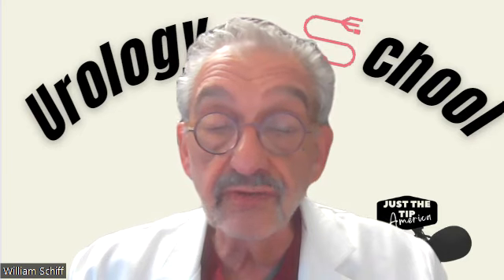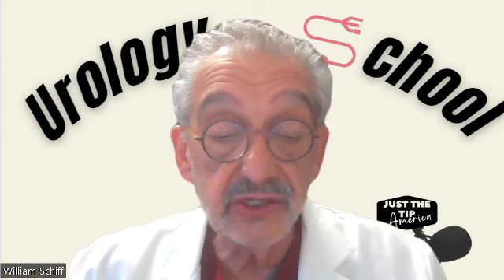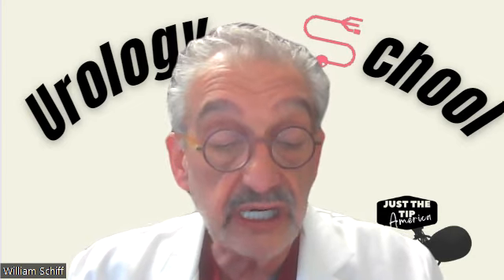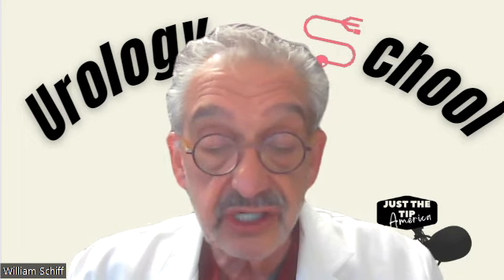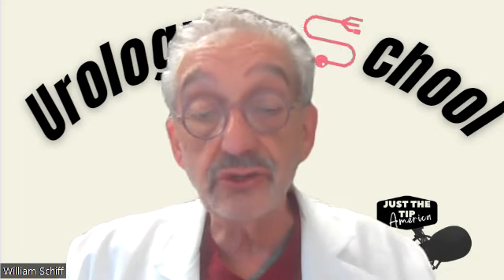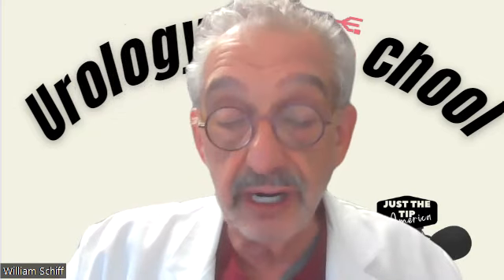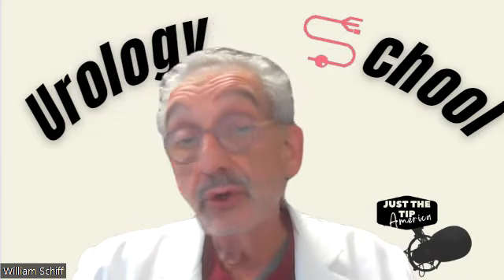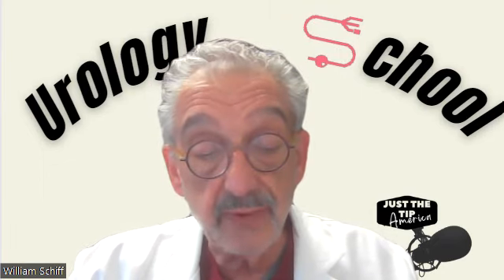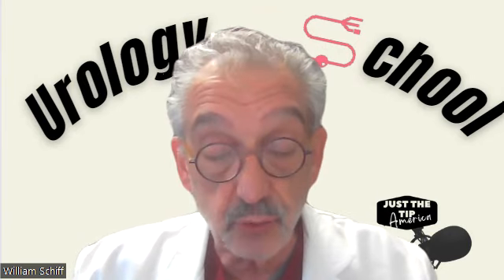MRI is the gold standard for tumor thrombus in renal cell carcinoma and is very specific for bony metastatic diseases. To get an idea of the MRI features of renal masses, go to the AUA core curriculum. Urothelial tumors are easily identified in MRI studies. We can look for renal function assessment as well.